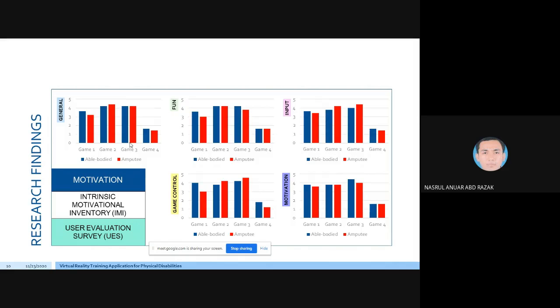Remember that this kind of system is not just for people who are having their prosthetic orthotics. It also can be implemented whenever you are already pre-prosthetic or post-prosthetic. You still need to keep your muscles active. So this is the way you should conduct your annual daily life activities, etc.